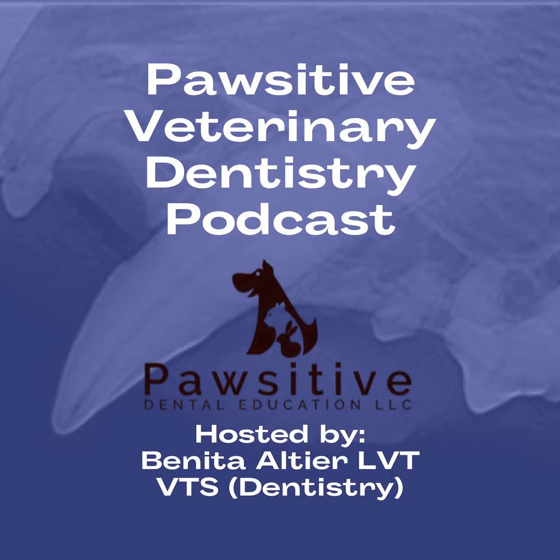What should their first steps be? I know you mentioned making sure it's not burnt cookies or it's too light, right? So contrast is super important. But what else would you say would be your mental checklist or your mental steps when it comes to looking at a dental x-ray? So another great question. So I do a lot of our radiographic interpretation for one of the other primary care doctors that does dental procedures.